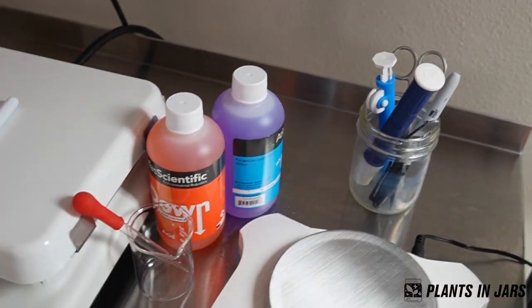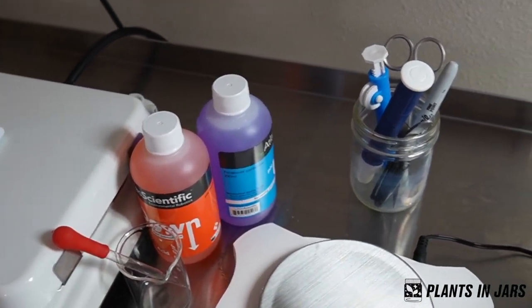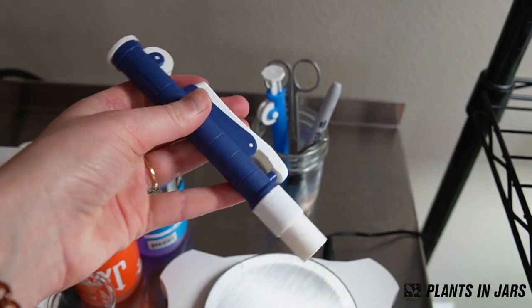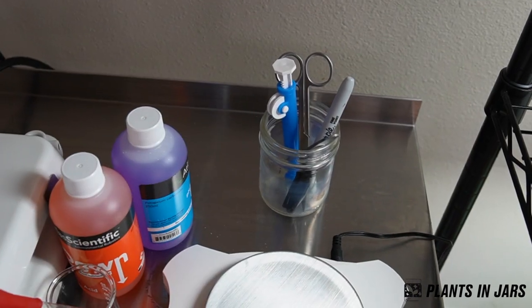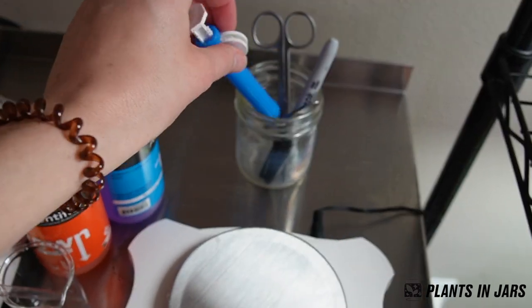For the pH of my tissue culture media I always just use the regular hydroponic pH up and down — I find that the easiest. I have a few pipette pumps. This one's from Amazon and it works great. This one's from Phytotech — it was $30 and it's broken. So thanks, Phytotech.